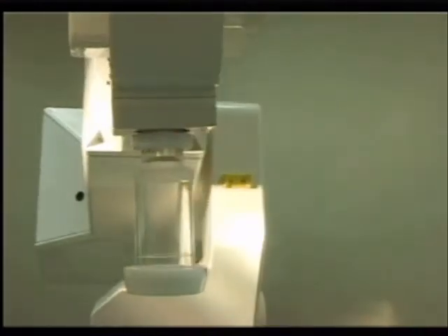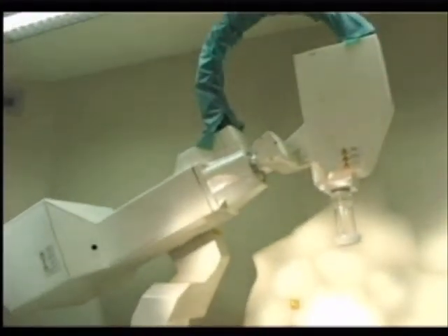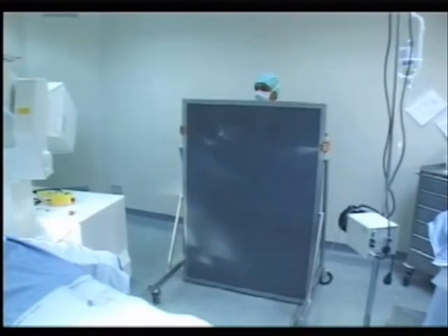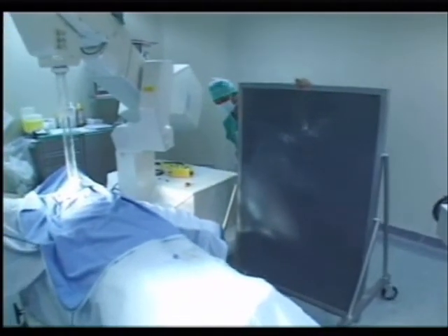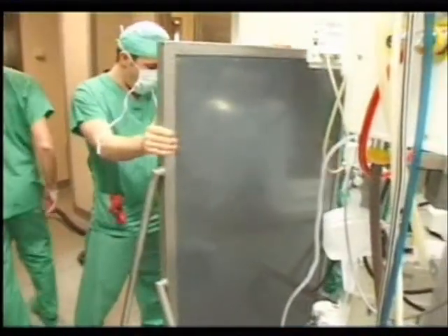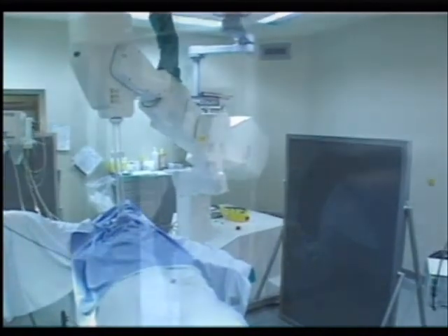The equipment generates different electron beam energies ranging from 3 to 9 MeV in 4 successive steps. When the equipment is beaming energy, very low energy electrons are generated around the applicators, but they can be very easily absorbed by appropriately designed mobile shielding, which makes it possible to contain radiation within the operating room.